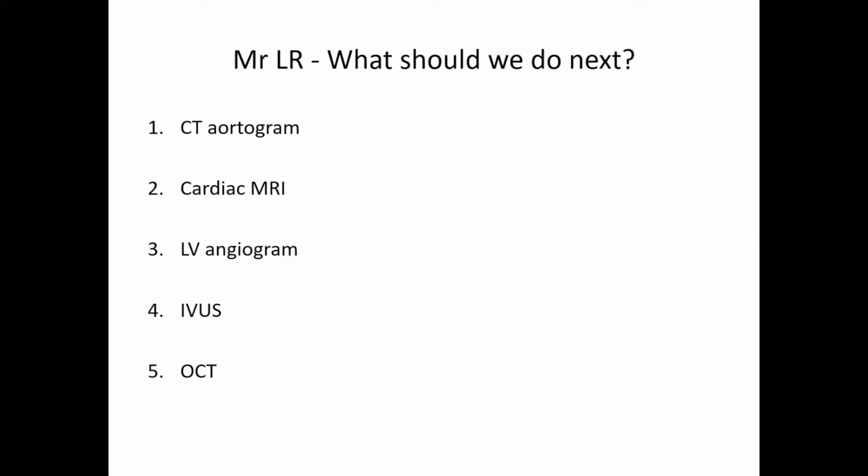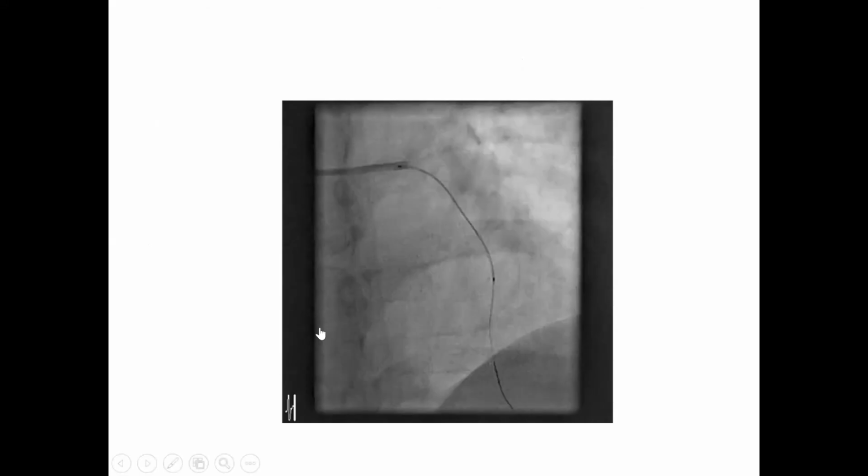Any comment from the panel? Just looking at this angiogram, it doesn't look particularly healthy for a 25-year-old, does it? It looks like he's got abnormalities with atherosclerosis, certainly within his LAD. That's right. And for that reason, when we are saying intracoronary imaging, I would definitely go for OCT in his case, because we want to see what the plaque morphology is like. Okay, so OCT, run that.